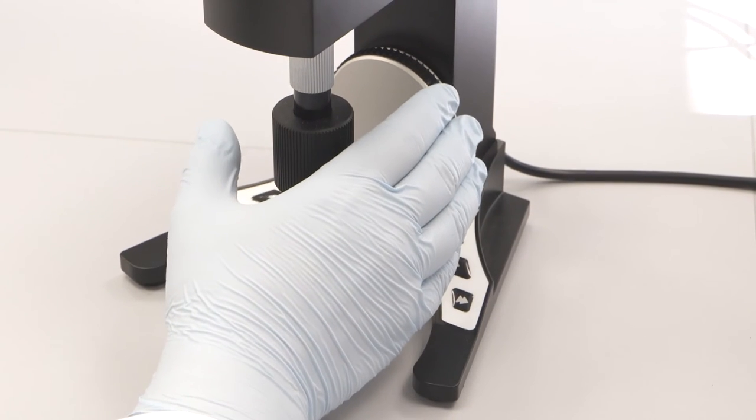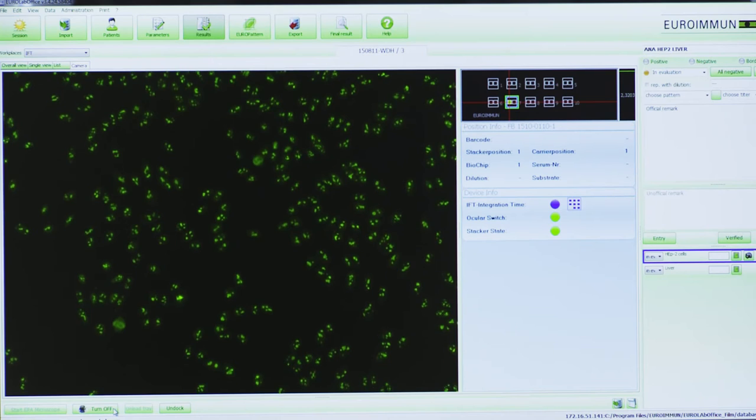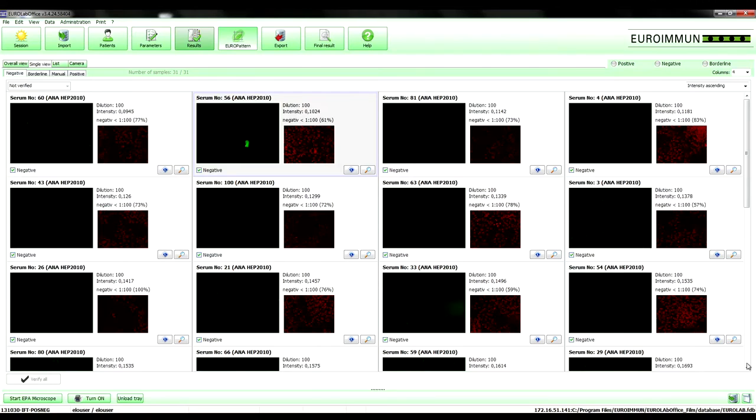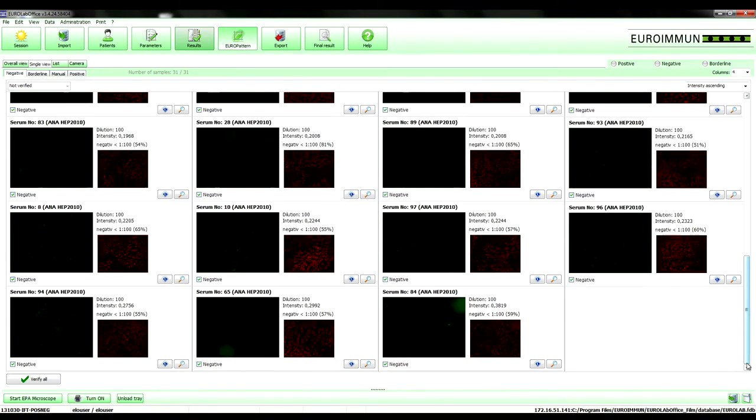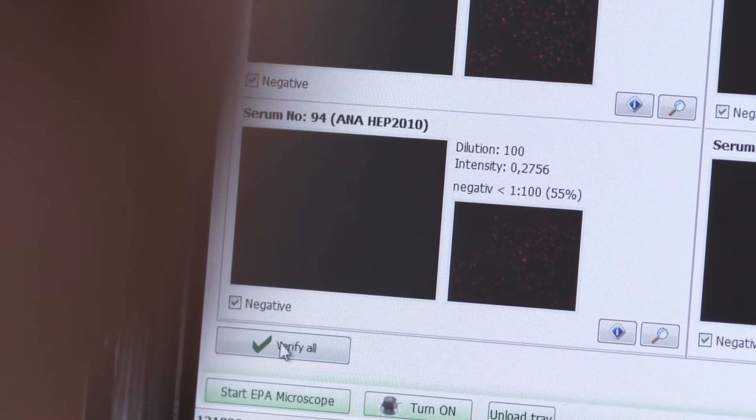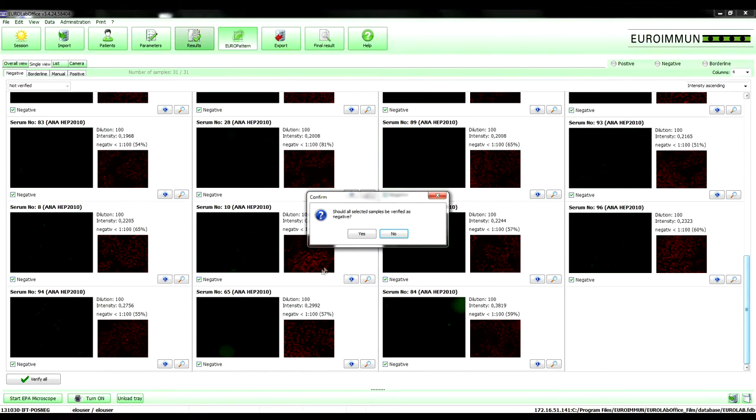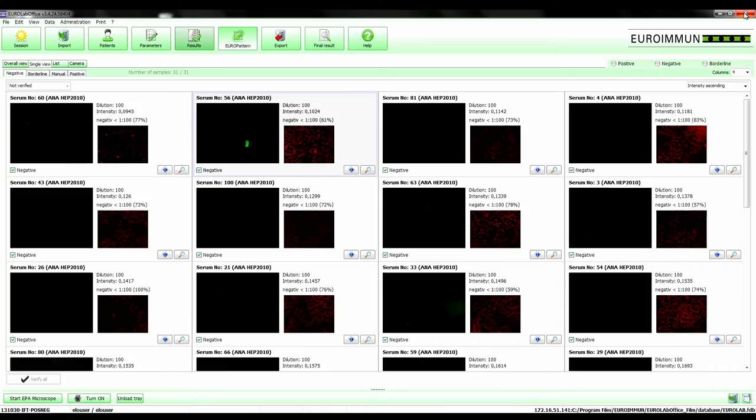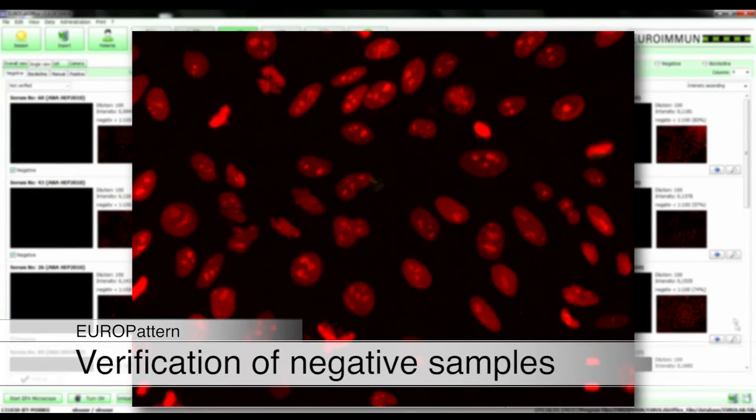Samples which are difficult to evaluate can be comfortably investigated in the live mode. Due to the network integrated software, diagnosis can be made at any workplace. The evaluation of results is possible already when the microscope is still working. The software allows for reduction of the verification effort for samples classified as negative by one mouse click. In order to avoid false negative results, the successful autofocusing is automatically checked.